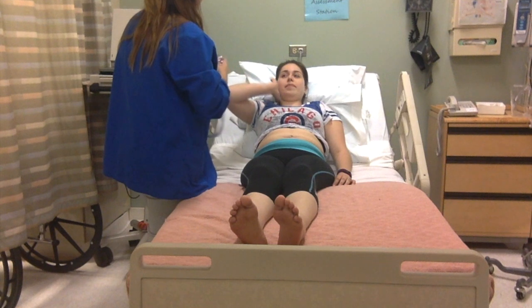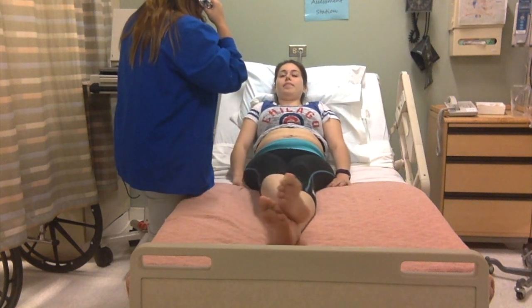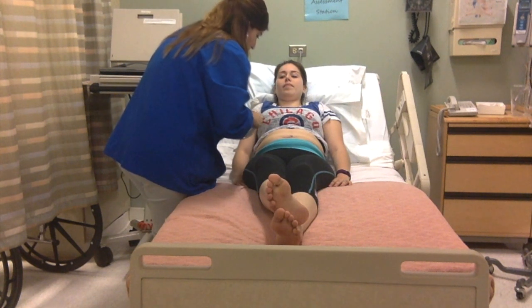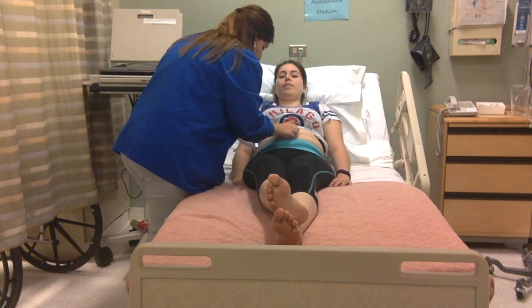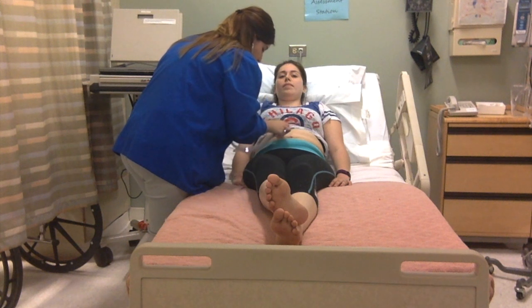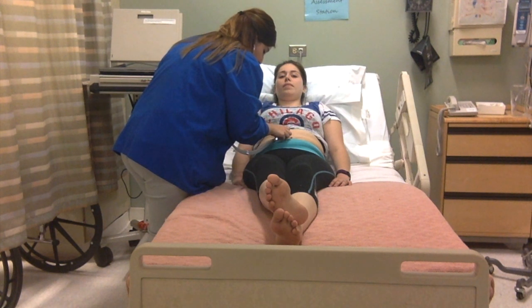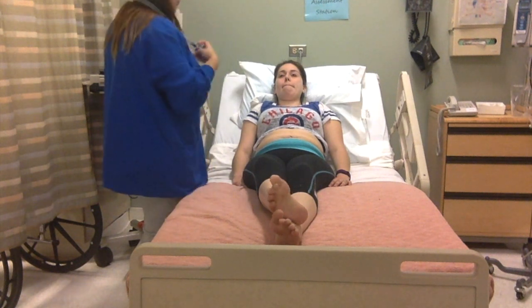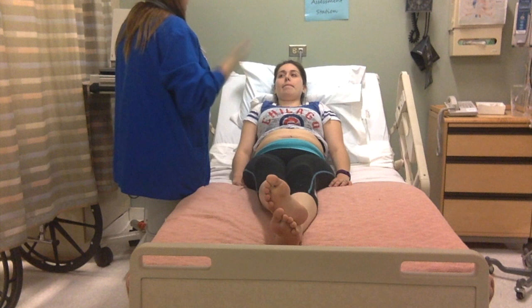While I'm here, I'm going to take a listen to your aortic and renal arteries. I'll listen with the bell of my stethoscope. So I could hear the aortic artery, but not the renal, which is okay in adults sometimes.